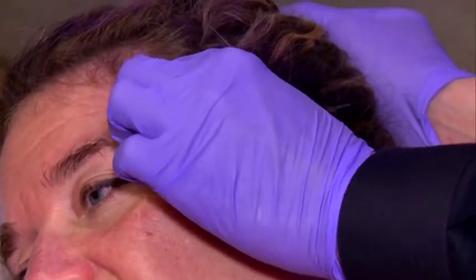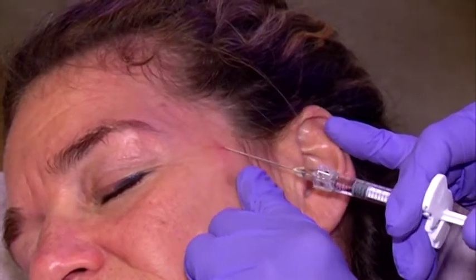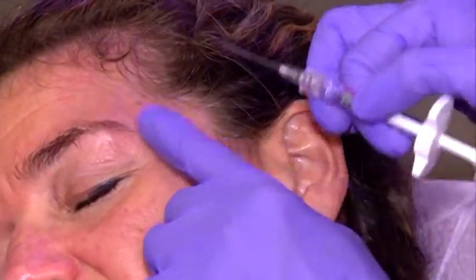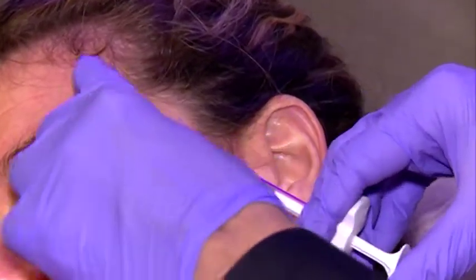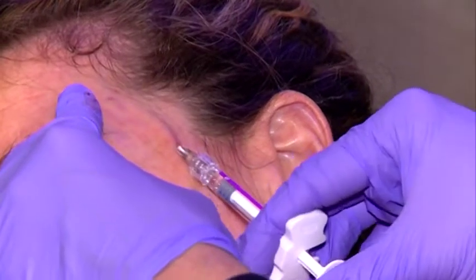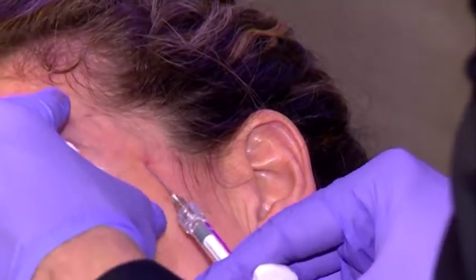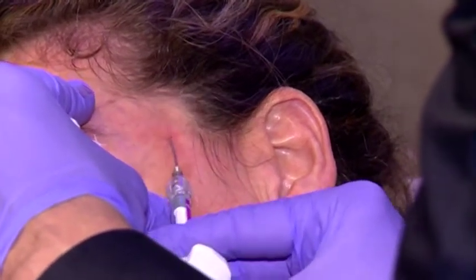If she's very hollowed, I go for the volume. And I have never seen any risks or side effects. The only thing is you see the irregularities a little bit more, and in the thin skin patient, the veins come up, like they do here anyhow as well a little bit. So what you see here is the veins coming up, which is absolutely normal. And yeah, we have to deal with it.